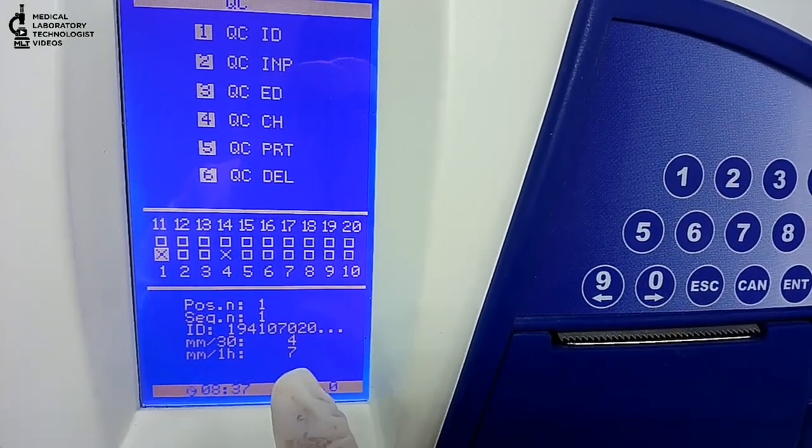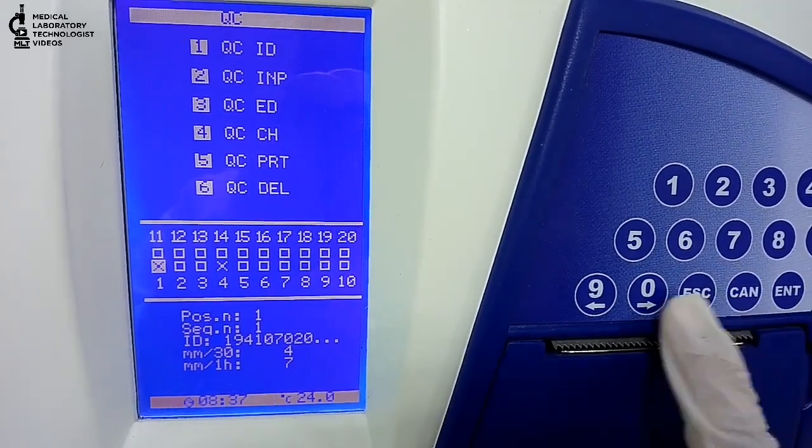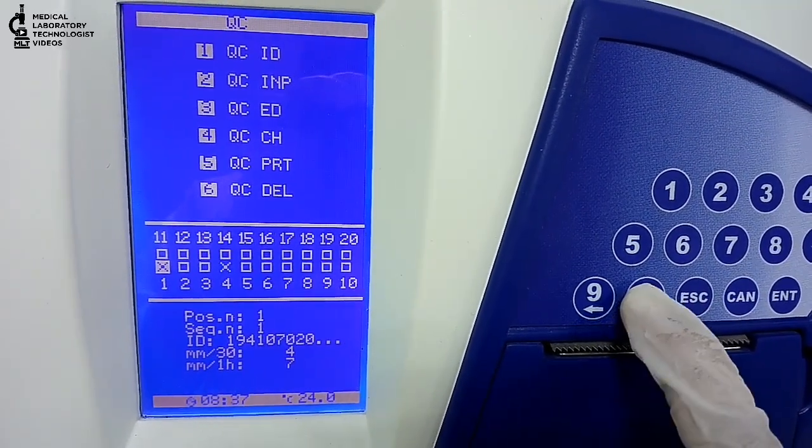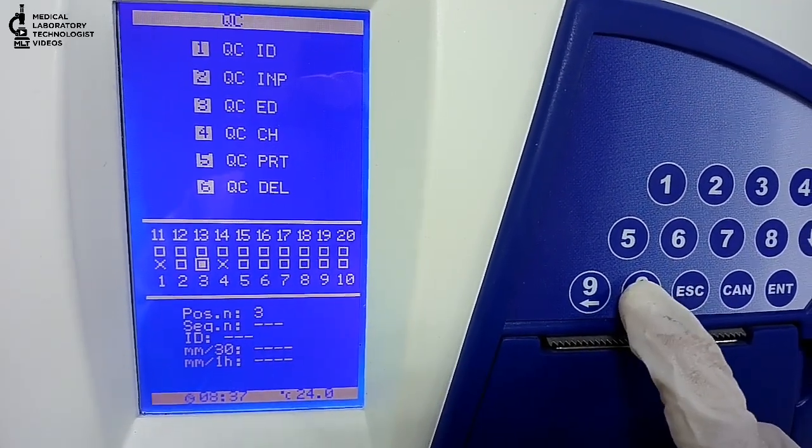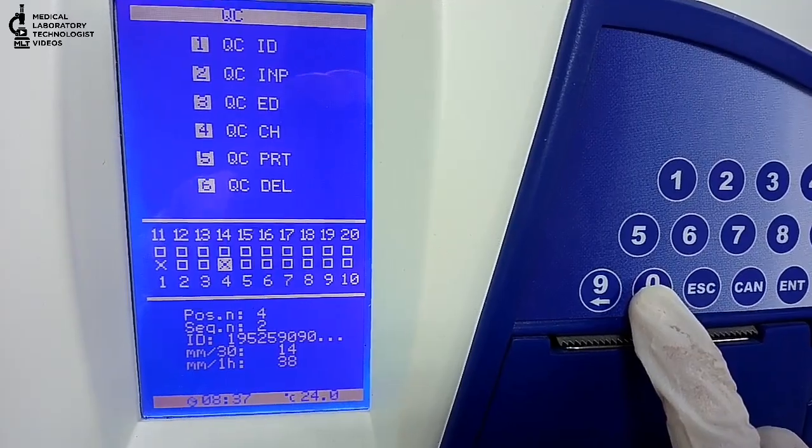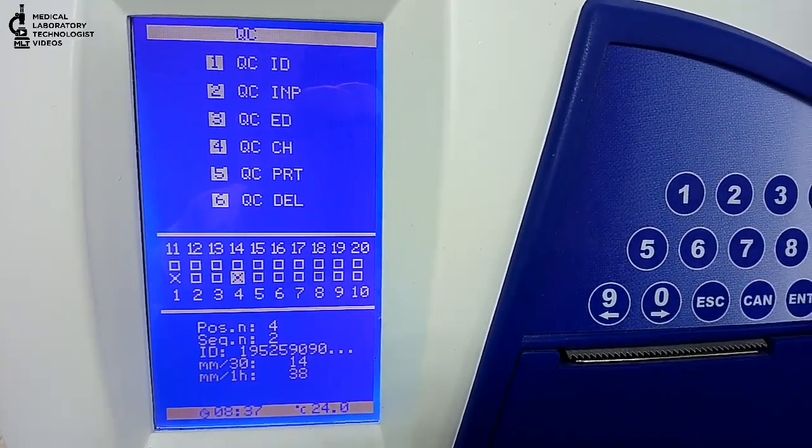When results will finish, then this cross sign will come. QC1 came 7, and abnormal control came 38, that was position 4.